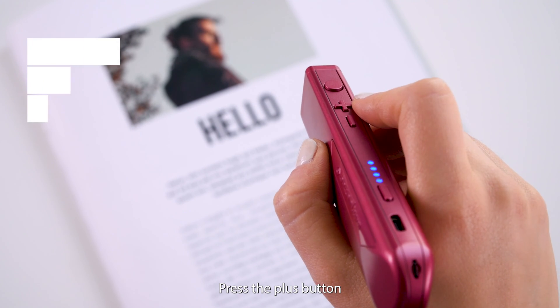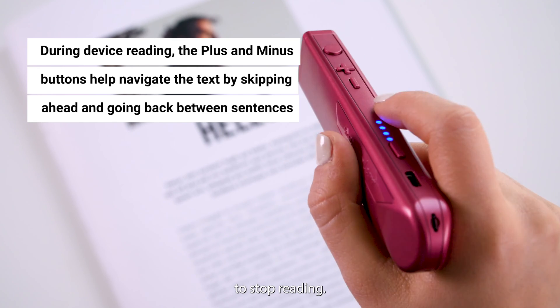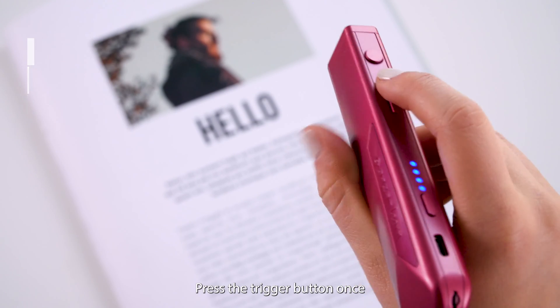To skip forward, press the plus button. To go back, press the minus button. To stop reading, press the trigger button once.